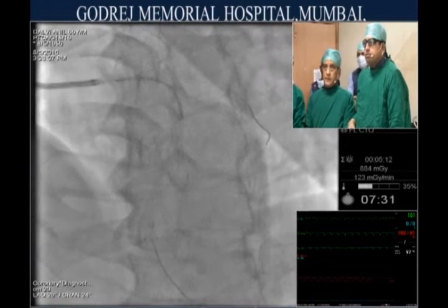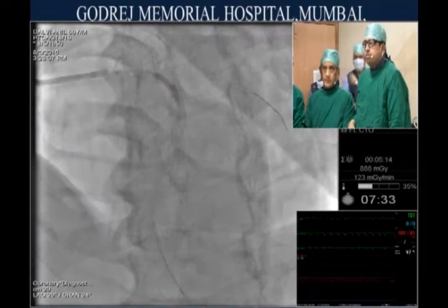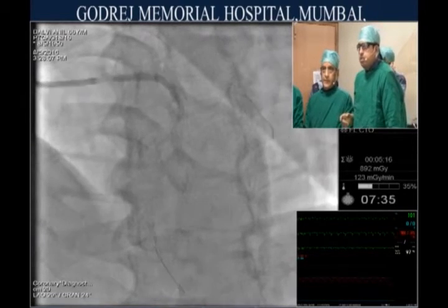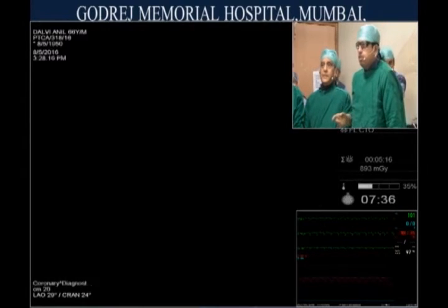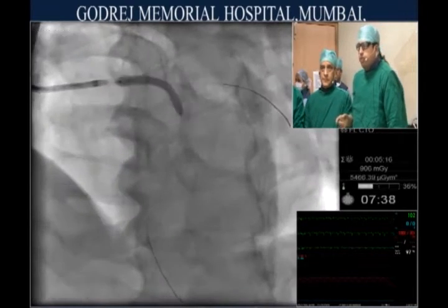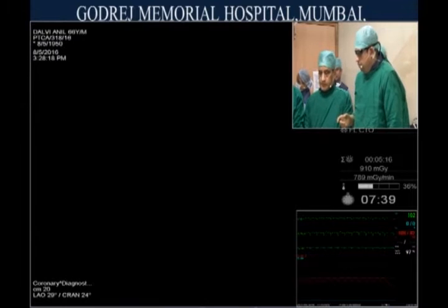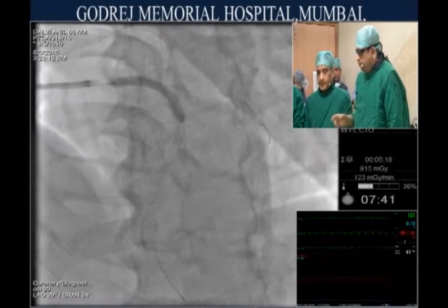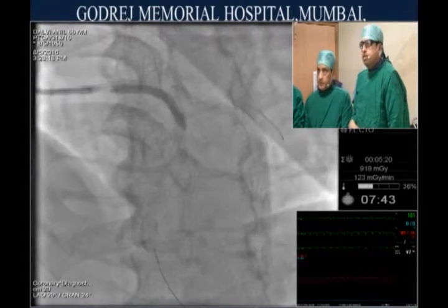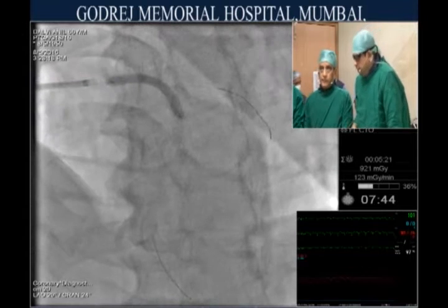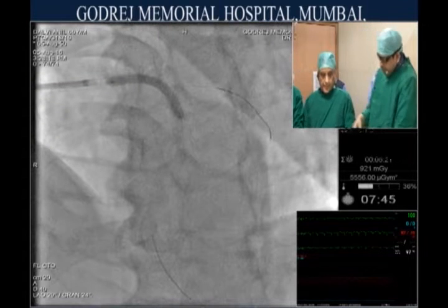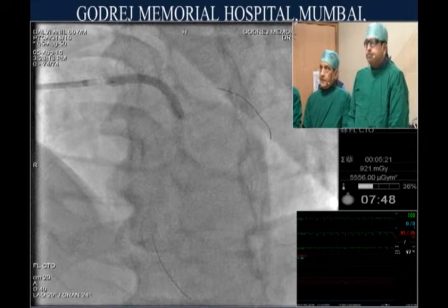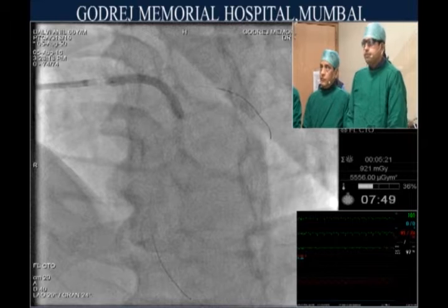Stent deployed: inflating to 2, 4, 6, 8, 10, 12, 14, 16 atmospheres — it covered the ostium. Deflate, negative. Quickly — let it recover. Breathe, a few seconds. Then we go one more inflation at 14 atmospheres. Saturation 97 percent.